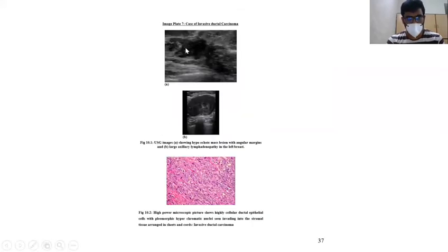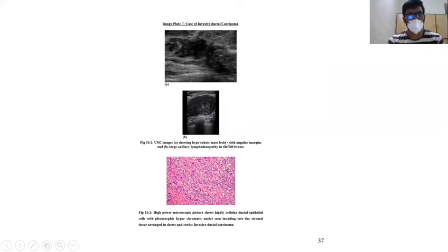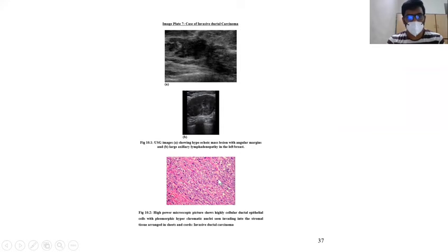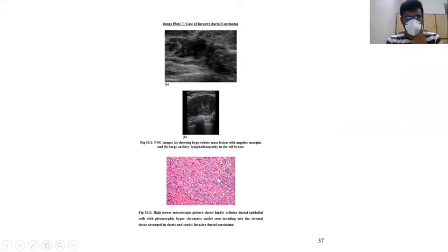This sonogram shows a hypoechoic mass with angular margins, and we can also see large axillary lymphadenopathy in the left breast. This picture shows highly cellular ductal epithelial cells with pleomorphic hyperchromatic nuclei seen embedded in stromal tissue arranged in sheets and cords.